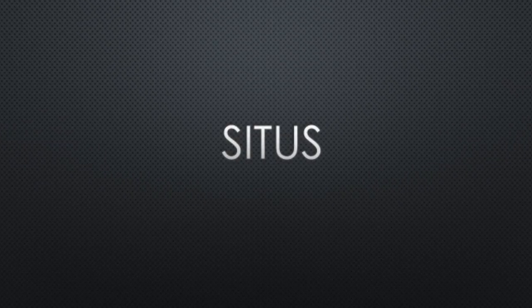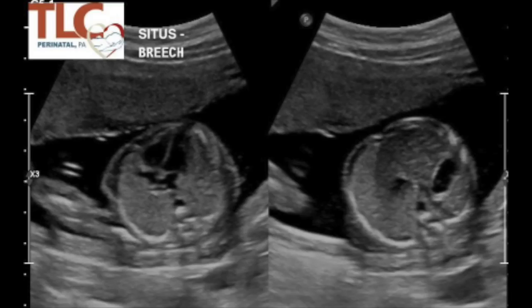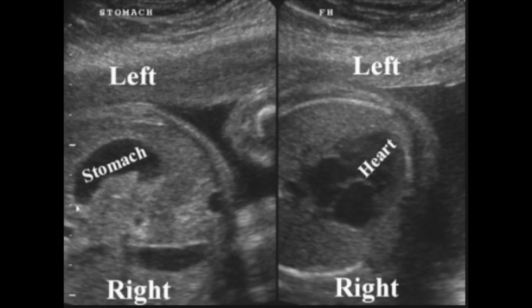You should always evaluate the position of the heart in relation to the stomach. The stomach and heart should both be on the left side of the body, also known as situs. When you document fetal situs, you should also note the fetal position, such as cephalic, breech, or transverse. A dual screen in the transverse plane can be used for situs documentation.